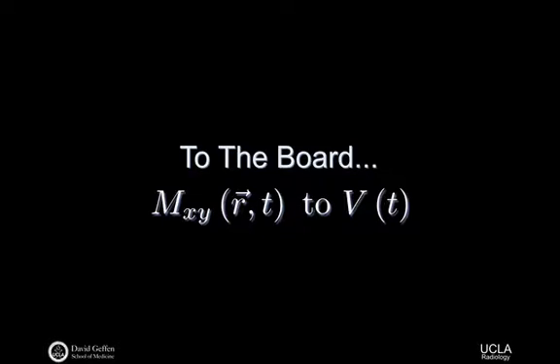Watch my brackets here. So that's the first term, and then there's a second term underneath here that's leading with the exponential term this time. So e to the minus t over T2 as a function of space, multiplied onto the partial derivative of the cosine term. So we have omega as a function of r times sine. Then just closing out this full partial term, you have a minus omega as a function of space times time, plus the phase from the RF pulse as a function of space. And that should close up there, and then close up the even bigger one.